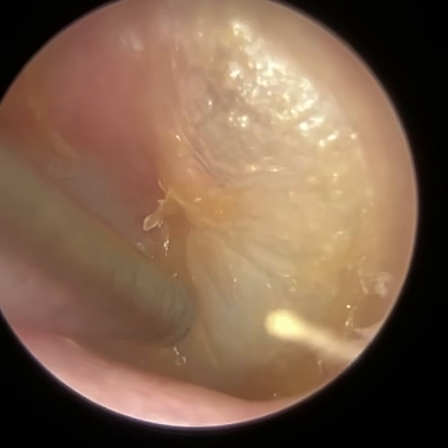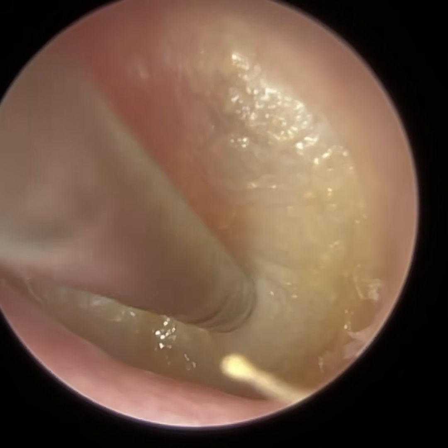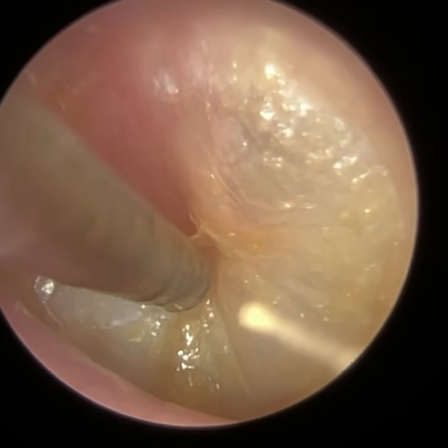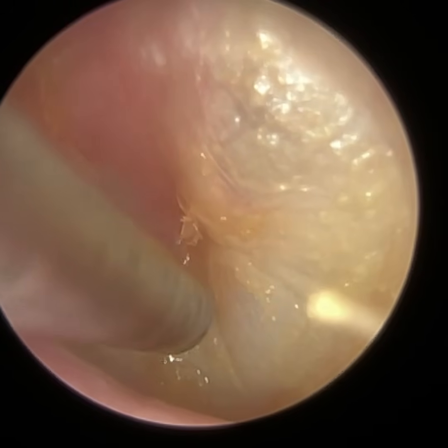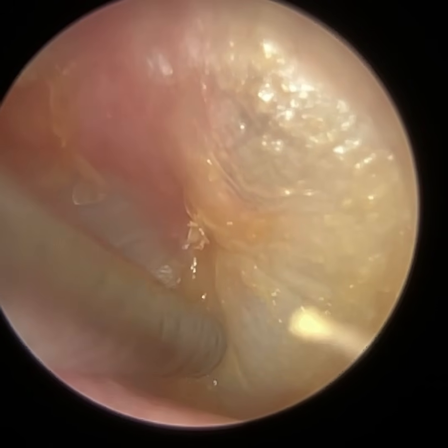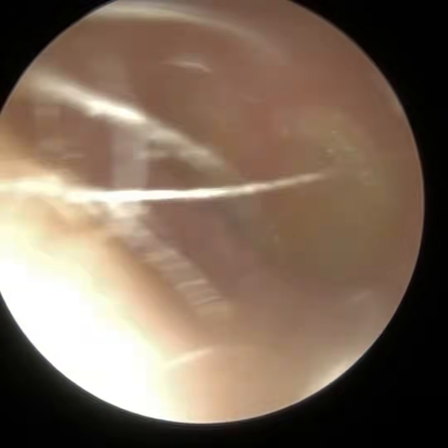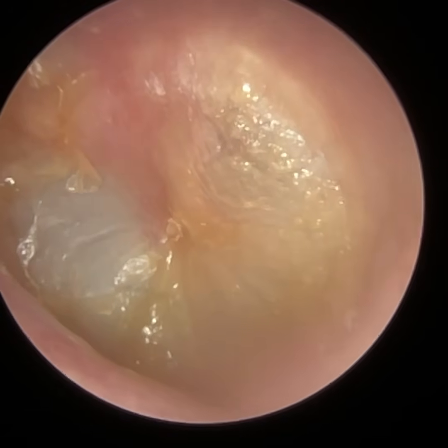And it is super, super thin, this layer of skin. And I'm just trying to get a hold of the skin so I can start peeling it, but I did get a hold of it there, but the skin just tore away. I think this is where the patient got a bit dizzy, so we left it.